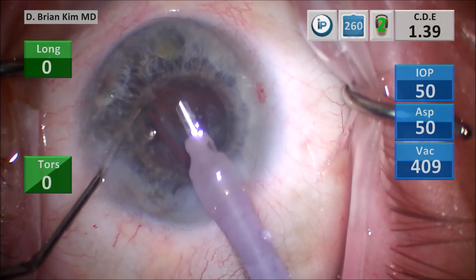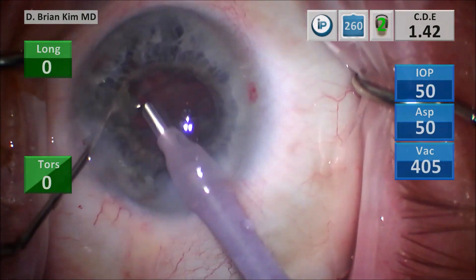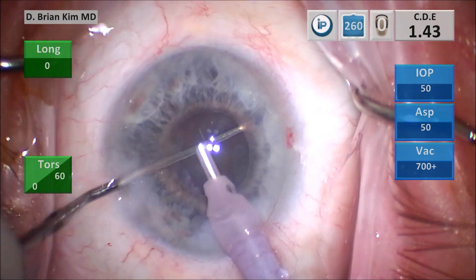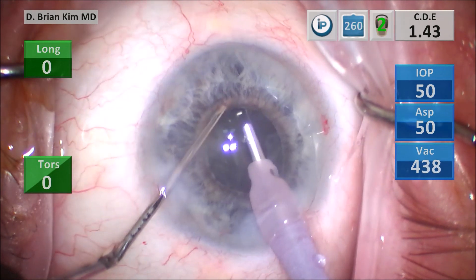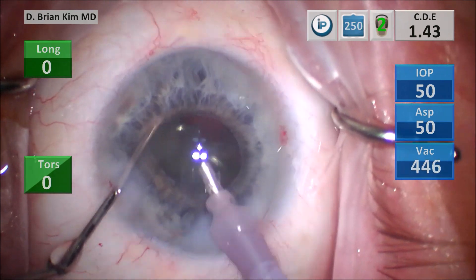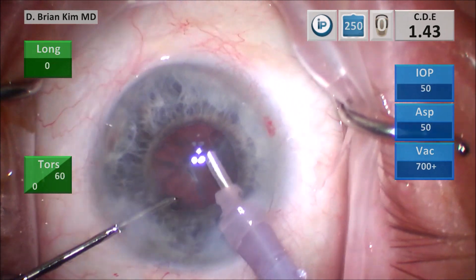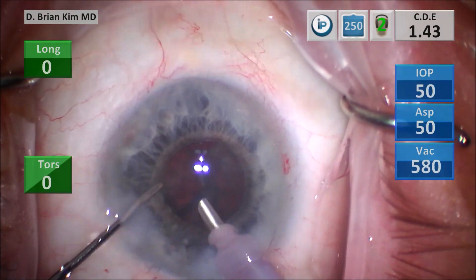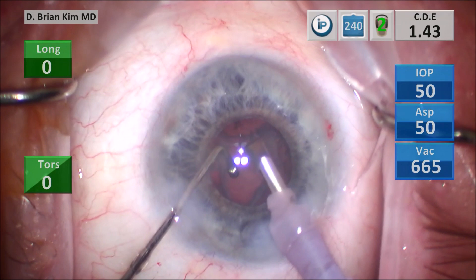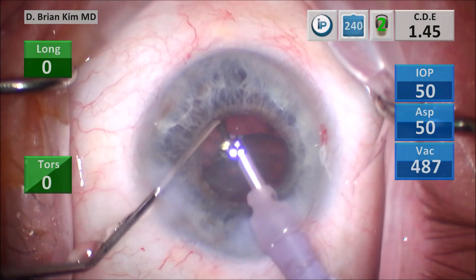This is a fairly soft lens. I'm trying to encourage the epinucleus to come forward. I placed the chopper around the epinucleus, pulled it centrally, and it was able to prolapse upward. Grabbing the anterior edge of the epinucleus, pulling it up. Notice as I go after the epinucleus on the left side, I use the chopper to pull back on the iris edge so that I don't grab the iris accidentally. I'm teasing the sub-incisional epinucleus from the posterior aspect, lifting it up, and it came out nicely.